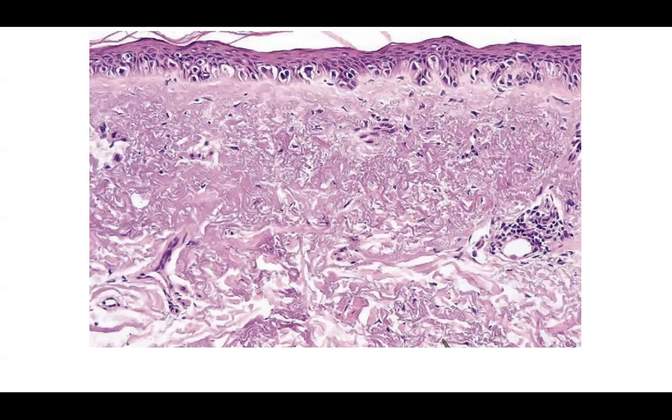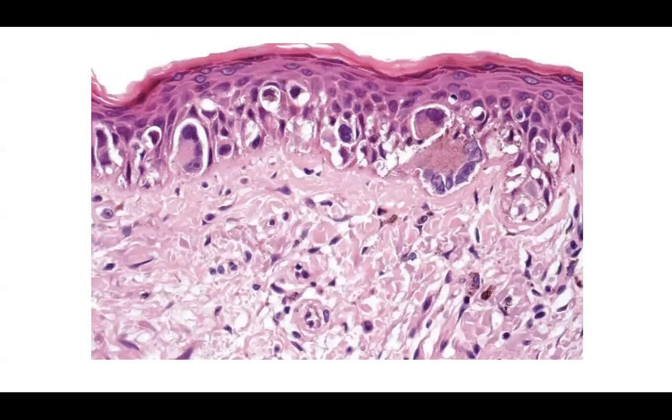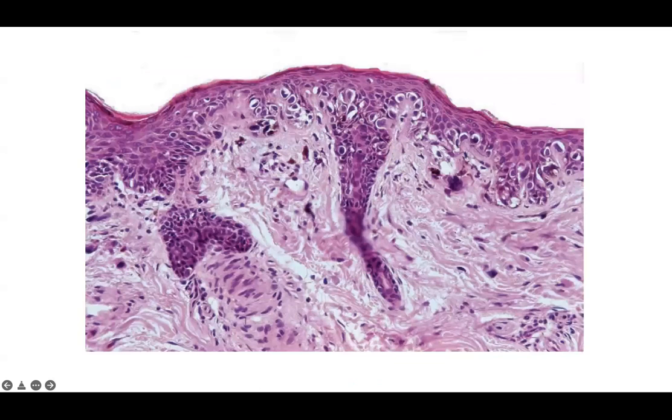However, this picture alone is clear that there's a melanoma in situ here, and you could just go ahead and make this diagnosis without any ancillary testing. You can see the loss of rete ridges here. It's a great example of atrophic skin, abundant solar elastosis with contiguous growth and focal pagetoid upward migration, even in this Lentigo maligna type. On higher power, you really see the striking atypical cytomorphology of the melanoma cells here. Again, more good examples of just that contiguous growth, pagetoid upward migration along the dermal epidermal junction.